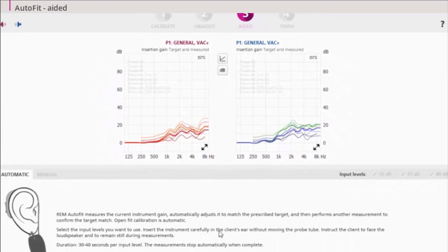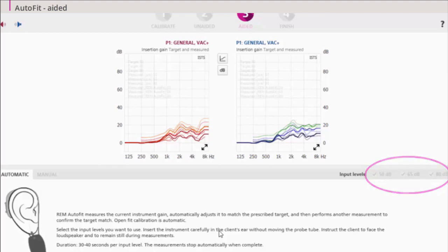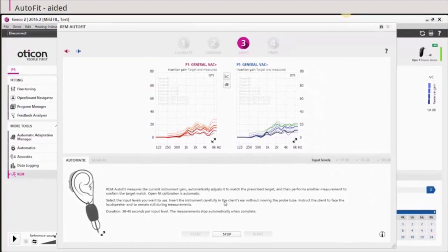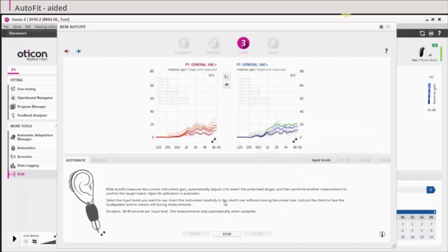The measurement can be done at 50, 65 and 80 dB. 65 dB is required, while 50 and 80 dB are optional. All three levels will be run if chosen, but only the 65 level will be used for calculating the gain adjustments in GENI. The calculated AutoFit corrections are linear and are applied equally for all input levels.